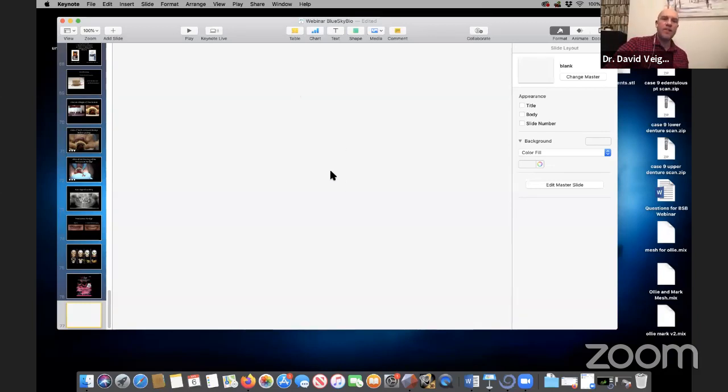Okay, what CBCT scanner for the spec? Yeah, good question. So most of my scans are done with a Carestream scanner. Now, a Carestream scanner has a specific scan appliance setting, which you go in, and what it essentially does is it turns down the voltage so there's not so much X-rays getting at the denture to burn it out.